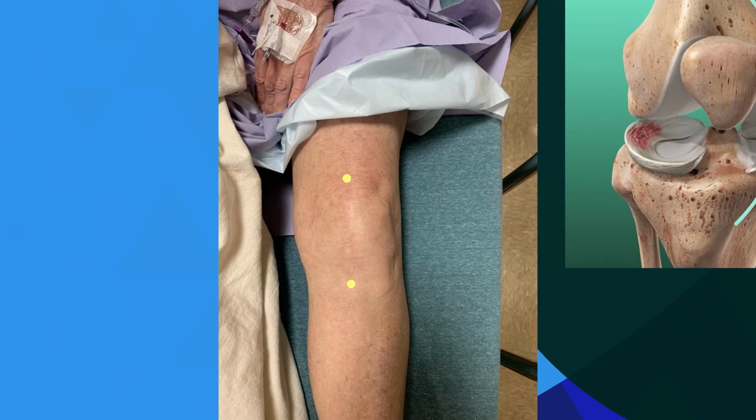So first, the skin incision. Now this patient's incision looks a lot better than average, I will tell you that. This has to do with the way we treat the skin during and after surgery, but also how the patient heals in general. Some people heal with small scars and thin scars, and some people don't. But this person is 1 year out from her left knee replacement at the time we're getting ready to do her right knee. And her incision here goes between the yellow dots.